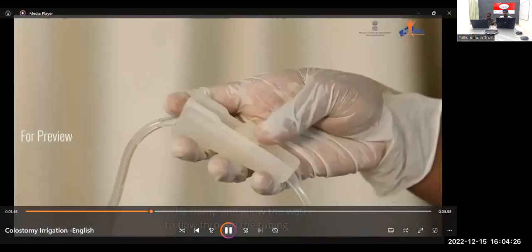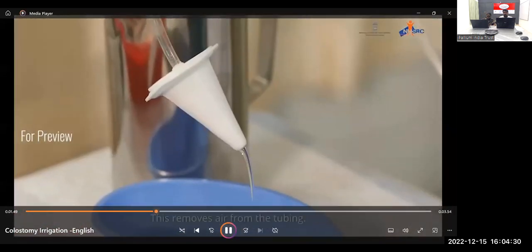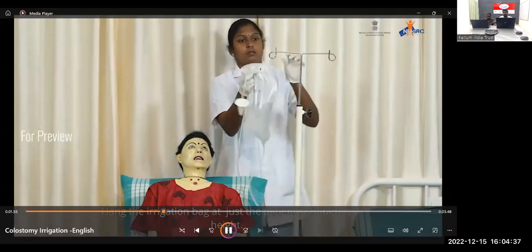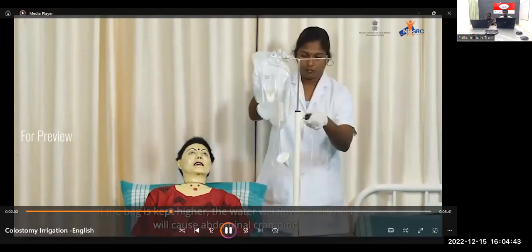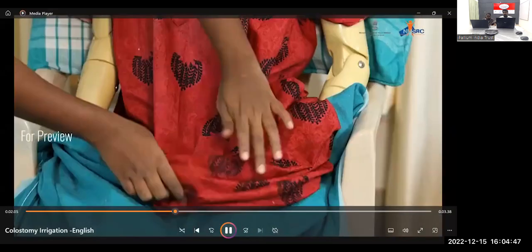Open the clamp and allow the water to flow through the tubing. This removes air from the tubing. Reclamp the tubing to off position. Hang the irrigation bag at just the patient's shoulder's height. If the bag is kept higher, the water will flow faster, which will cause abdominal cramping.